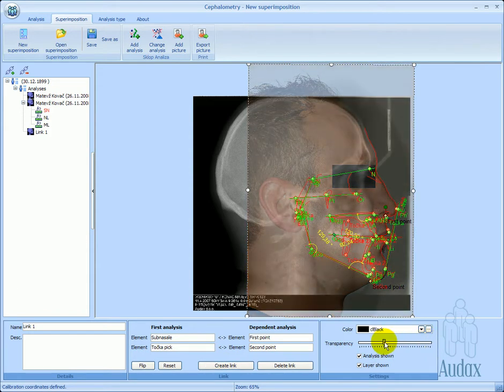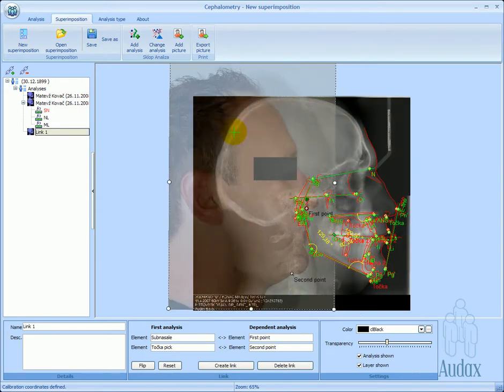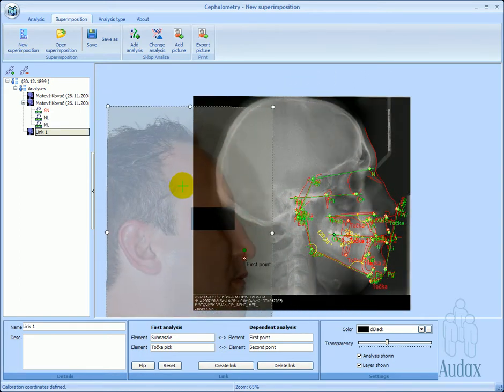By using the skew and rotation tool, the patient's image can be aligned to the visible profile on the x-ray image.